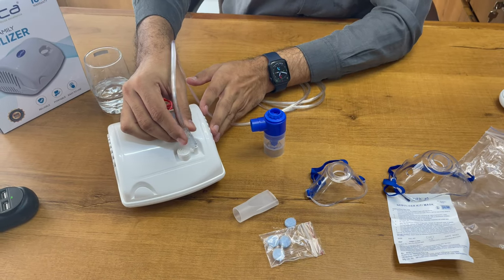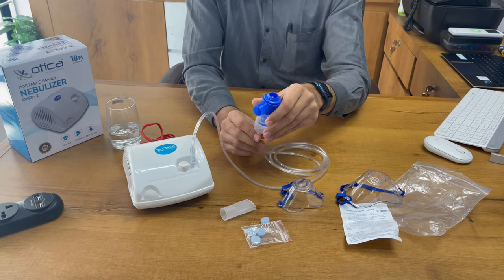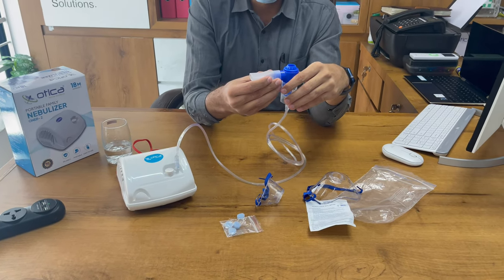This is the connection — you have to apply this tube on this connector, and the other part of the connector will connect to the nebulizer chamber.